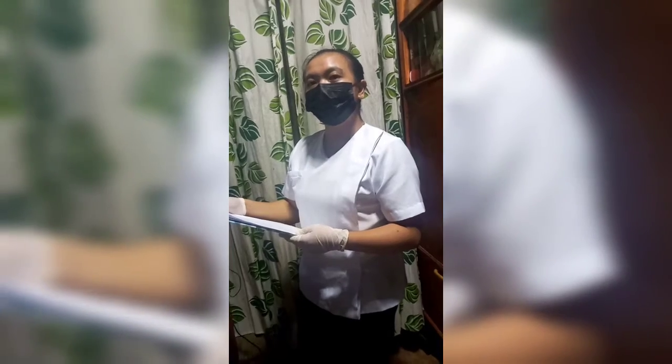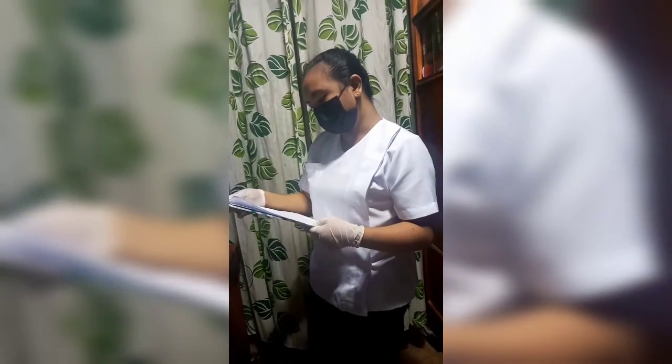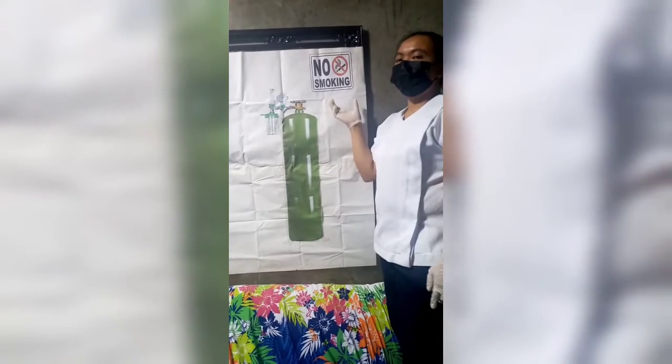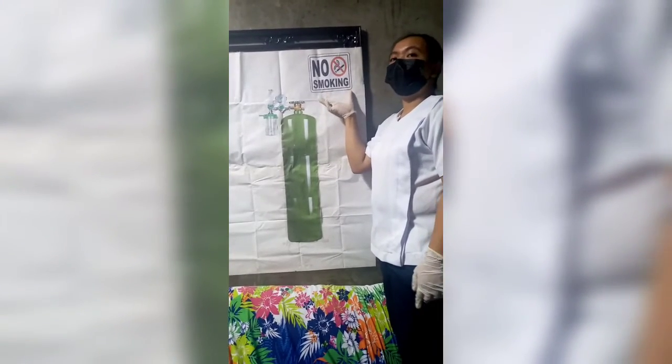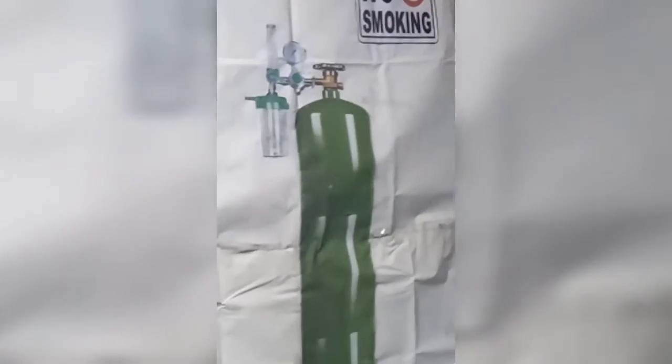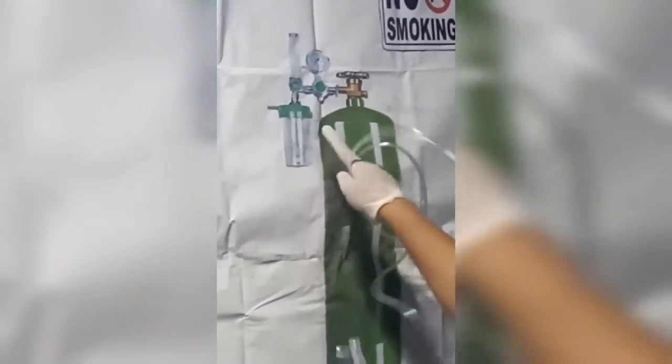Review safety precautions necessary when oxygen is in use. Place no smoking signs in appropriate areas. The next step is to connect the nasal cannula to the oxygen setup with humidification if one is in use.